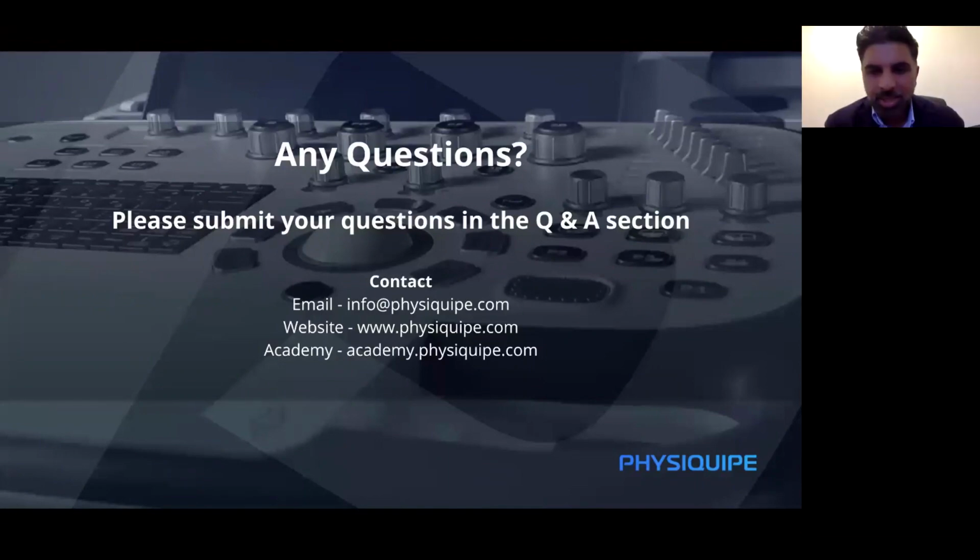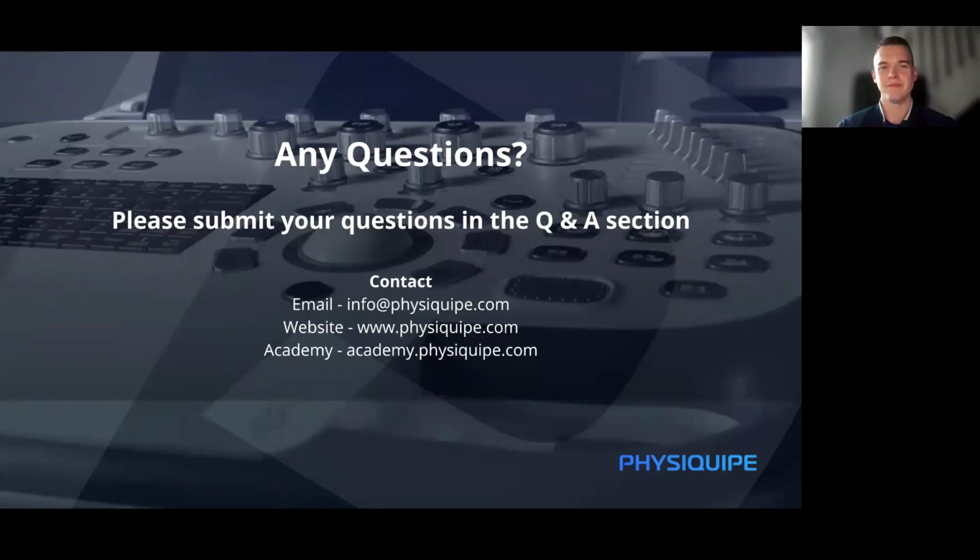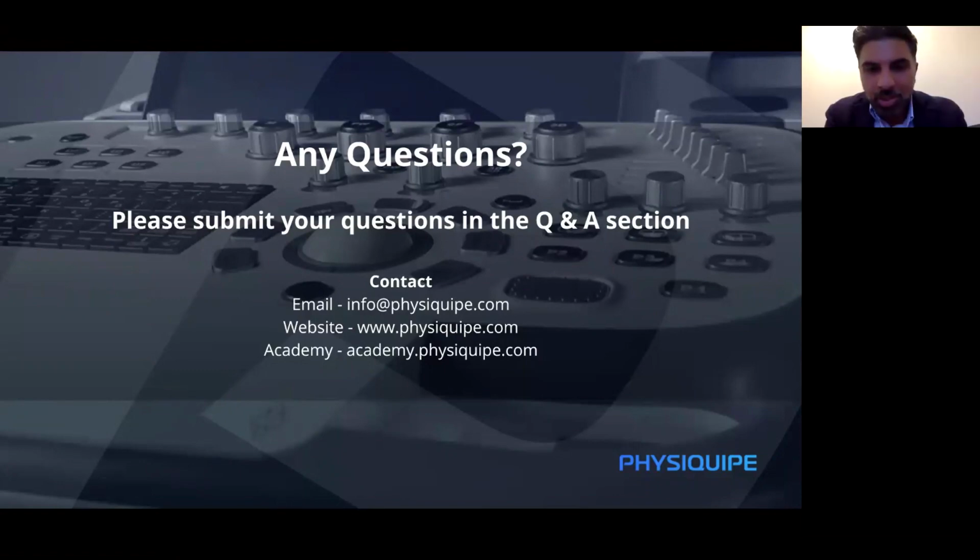I think that's a really good question, because sometimes people can get very carried away once they learn ultrasound and want to use it on everyone. The first answer is no, you can't use it on everyone. I don't use it on everyone because I don't have the time, and it's not necessary for everyone. There's a select group of patients that need it. The way we do it in my practice is that we have what we call an early arthritis one-stop shop clinic.